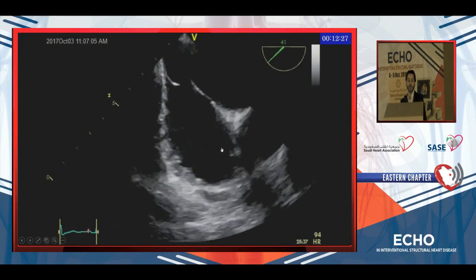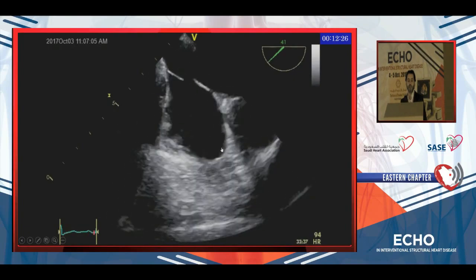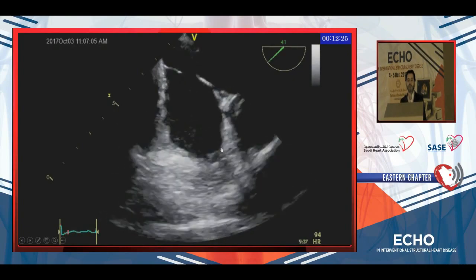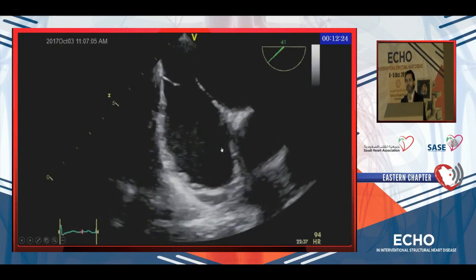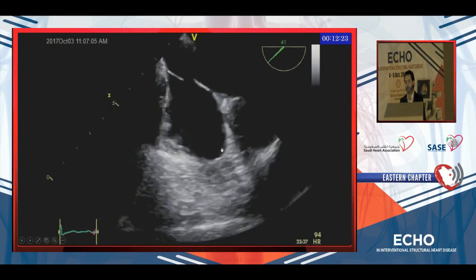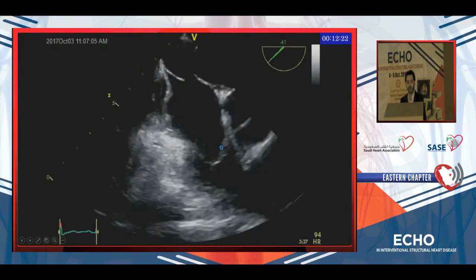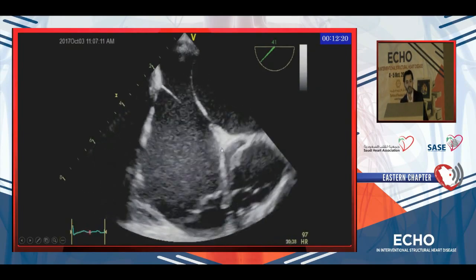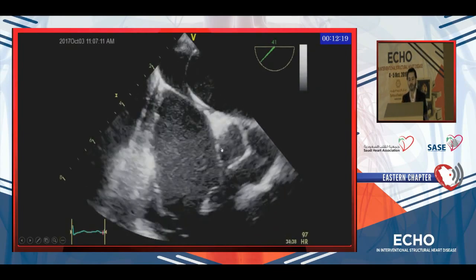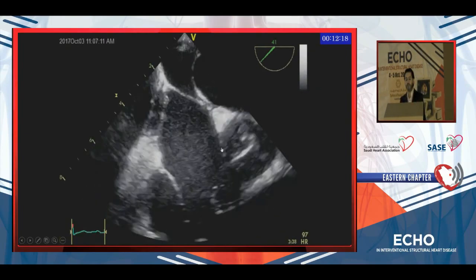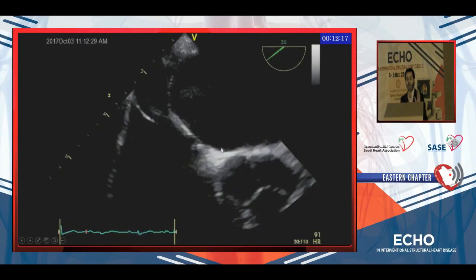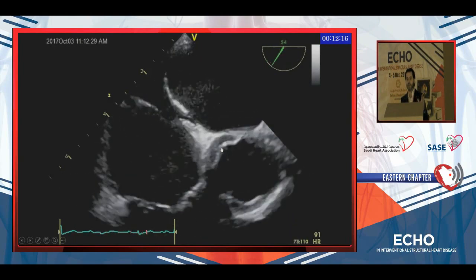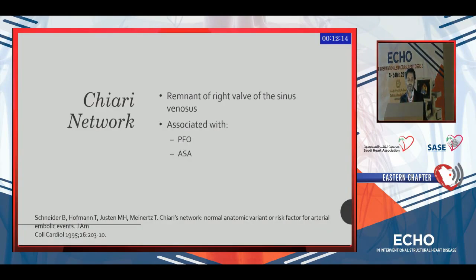Here you can see the Eustachian valve — sometimes it can be tricky if your gain is too low, so just increase the gain and you can see how it directs the IVC blood to the fossa ovalis.